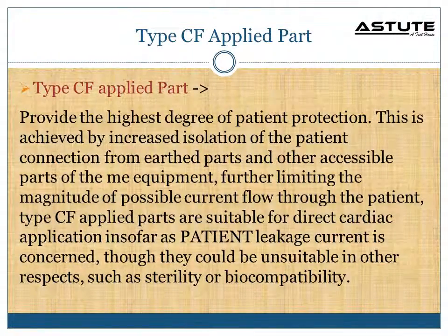Type CF applied parts provide the highest degree of patient protection. This is achieved by increased isolation of the patient connection from earthed parts and other accessible parts of the ME equipment, further limiting the magnitude of possible current flow through the patient. Type CF applied parts are suitable for direct cardiac application.